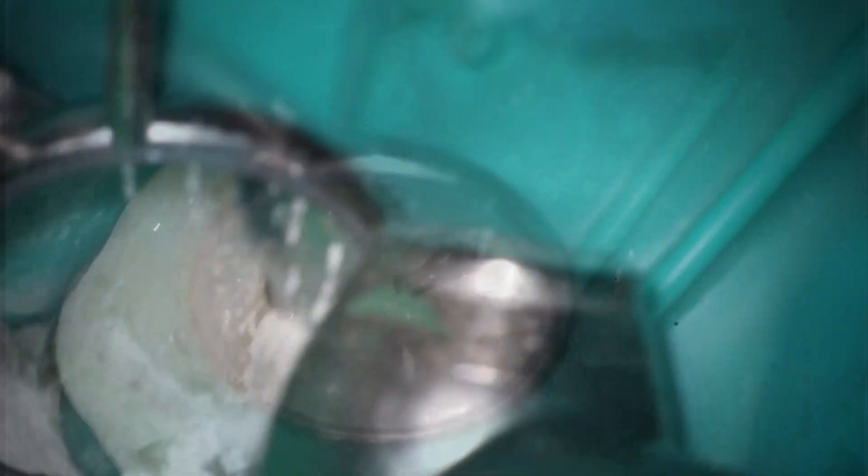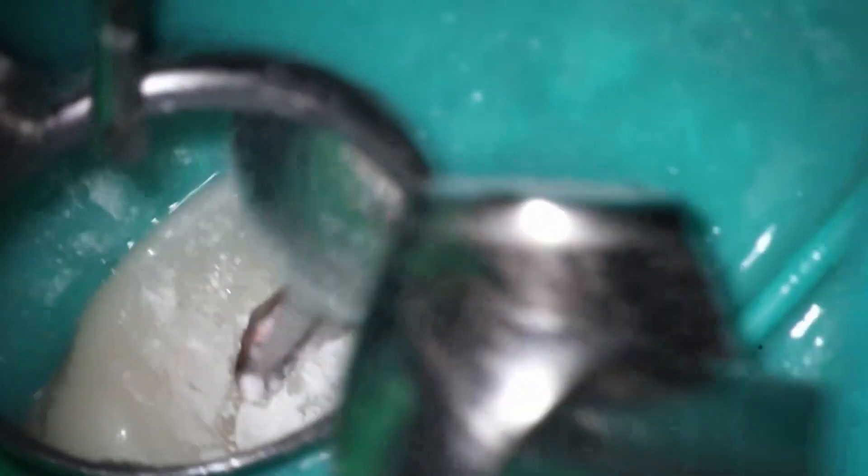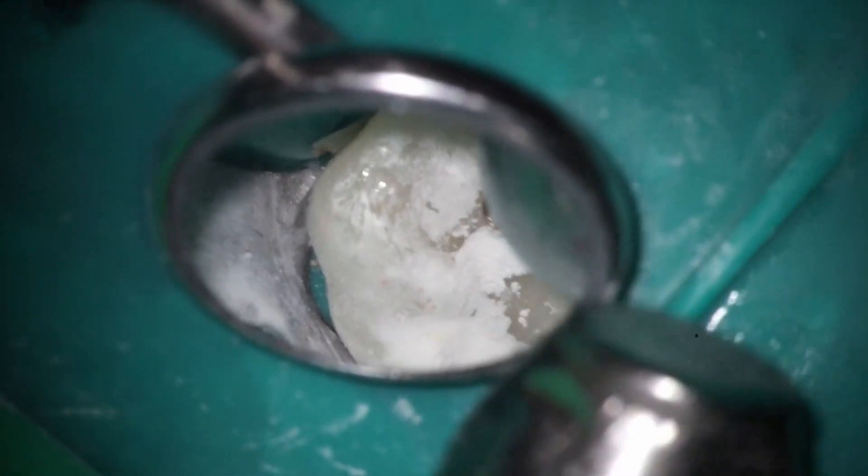As you can see from those initial images, the infection was large. This is not going to be one of my minimally invasive cases. There is a missed MB2 as well that we'll go after. What I like to do on retreats is get inside and try to remove just composite — not remove any tooth structure if possible. I'm using that little skinny 850 to expose the composite. This is a thermofil case.